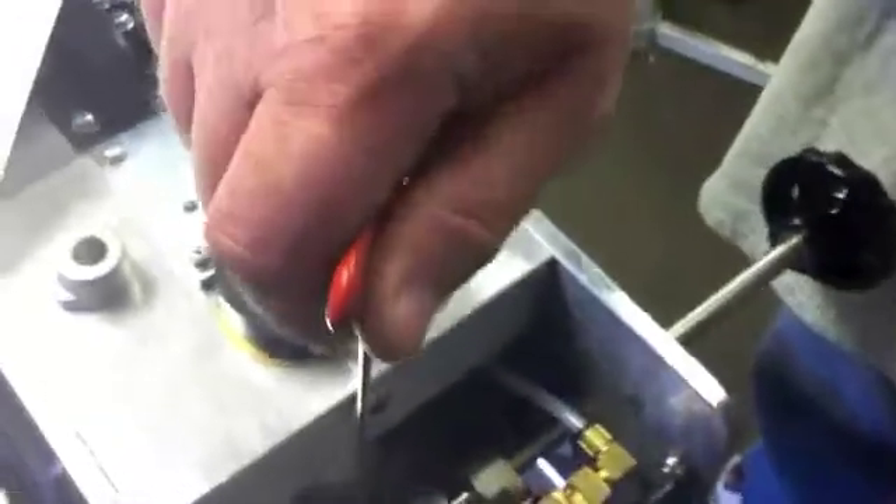We'll take our eighth-inch T-handle Allen wrench and loosen the set screw on the cam. We'll then move that cam out of the way of the trumpet valve. We can see some daylight or gap between the trumpet valve and the cam. To verify correct gap, we take our 15 thousandths feeler gauge, place it in there, and move the cam into contact with the feeler gauge. Then we go ahead and tighten that set screw.